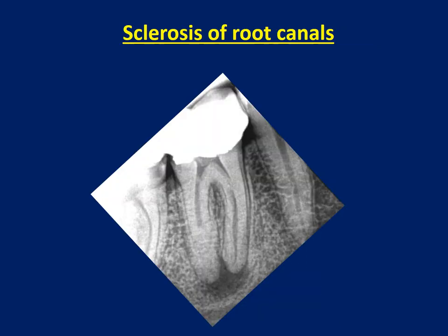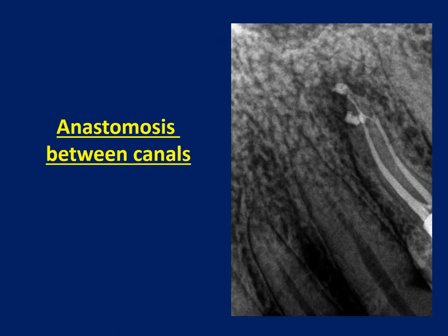For example, sclerosis of the root canal: the distal canal is fully sclerosed for half the length and the mesial canal is sclerosed in the coronal area, with a very large lesion present. Anastomosis between canals — you can see that there is an anastomosis between the buccal and the palatal canal in the apical region where they join and form one canal.